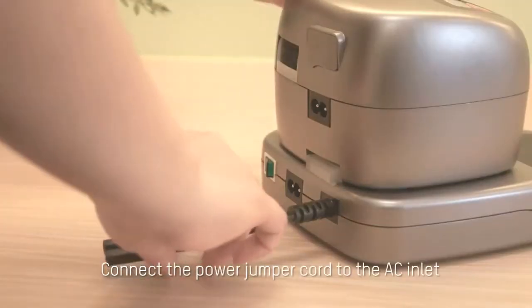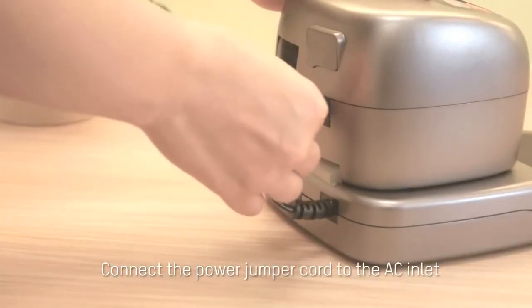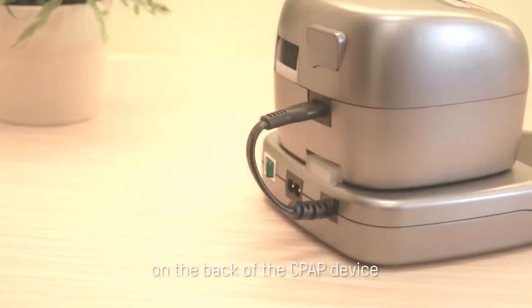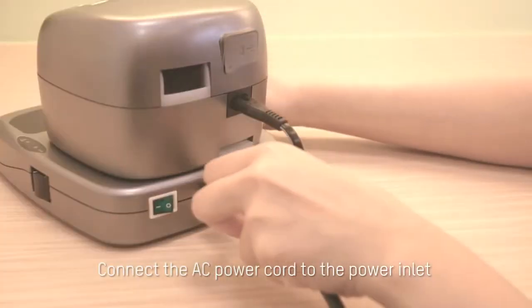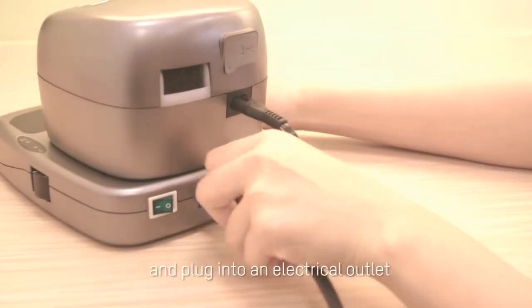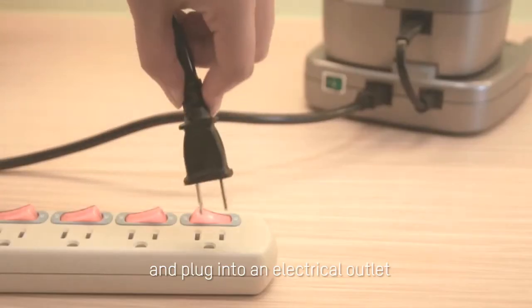Connect the power jumper cord to the AC inlet on the back of the CPAP device. Connect the AC power cord to the power inlet on the back of the heater and plug into an electrical outlet.